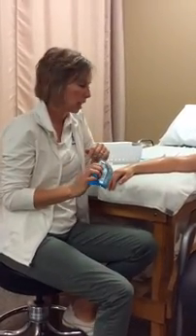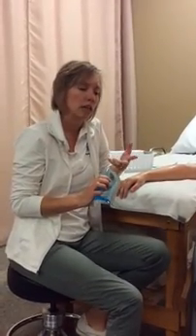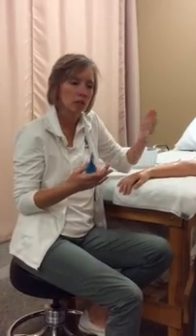So a couple things that the ASTYM does: one, it helps us find where the problem area is. The second thing is it helps restart the healing process to realign some of those tissues. So we stimulate that area and increase the blood flow to that area so that those tissues can heal normally.